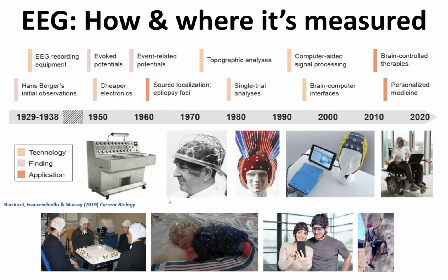So the 1970s, in particular, Derek Fender out at Caltech was developing some of the first high-density EEG caps, which you can see here in this excellent photo from Caltech magazine back in, I think, 1972, if I remember properly. And you can see it's moved a long way from pen and paper EEG up through some of the great 1980s images of what EEG caps can look like, into more mobile devices. Here is an ANT system, as well as completely mobile and wireless EEG that can be used in all sorts of environments. We'll come back to that momentarily.